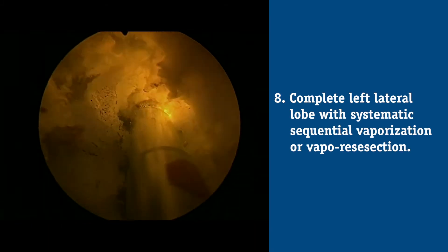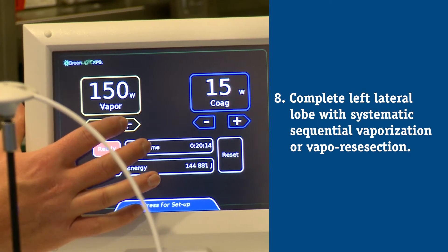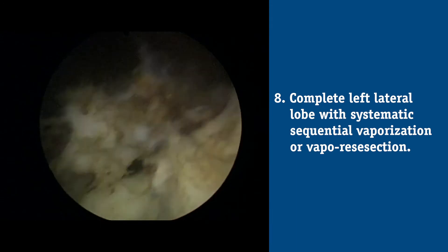Once you've identified the capsule above and below that tissue, and also at the bladder neck and distally at the apex, I feel comfortable turning my energy to 180 watts and vaporizing between these grooves — or vapor resecting pieces of tissue that I sweep into the bladder and later extract. Once I do that portion, I evaluate the floor or the base of that lateral lobe.